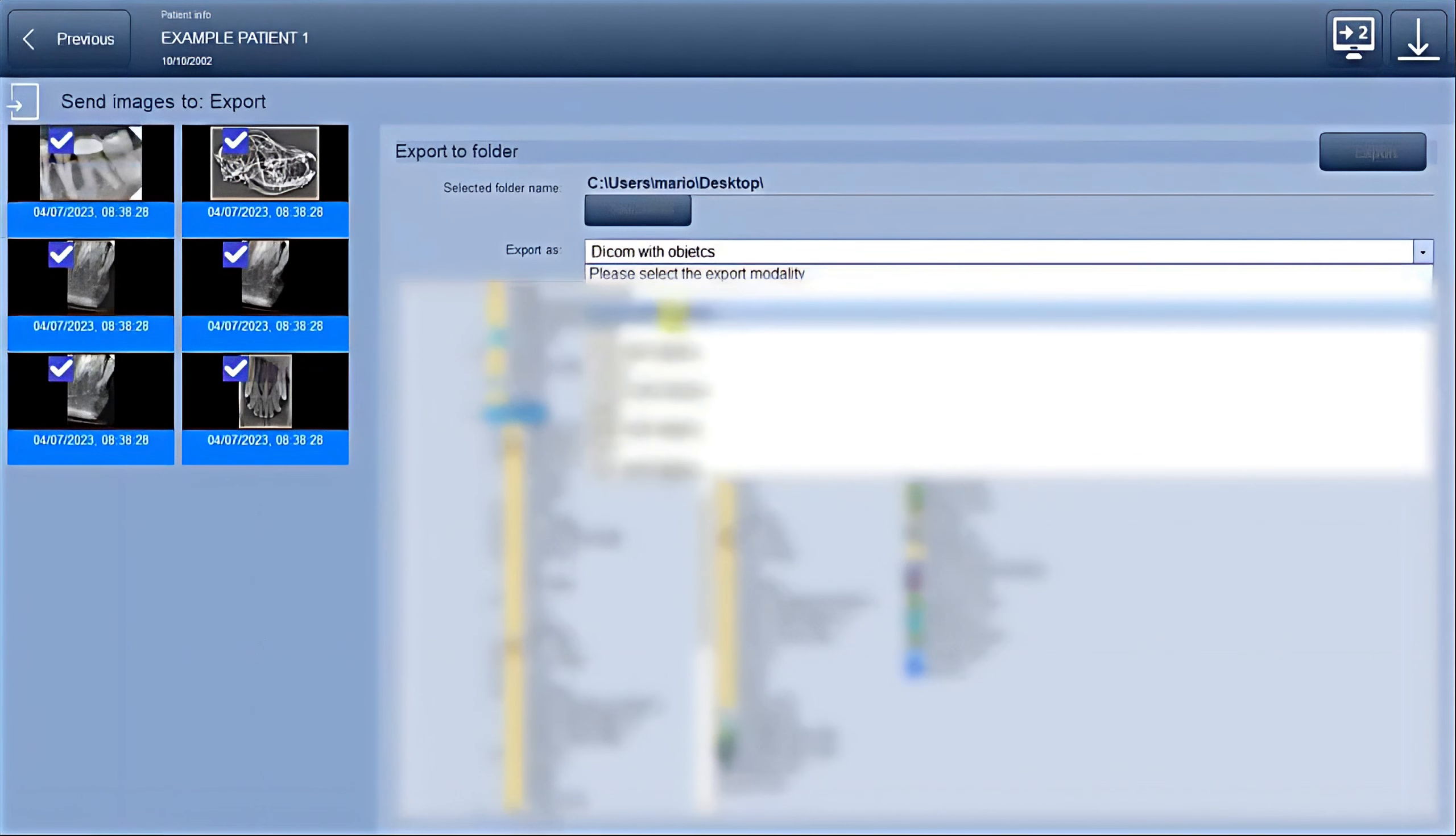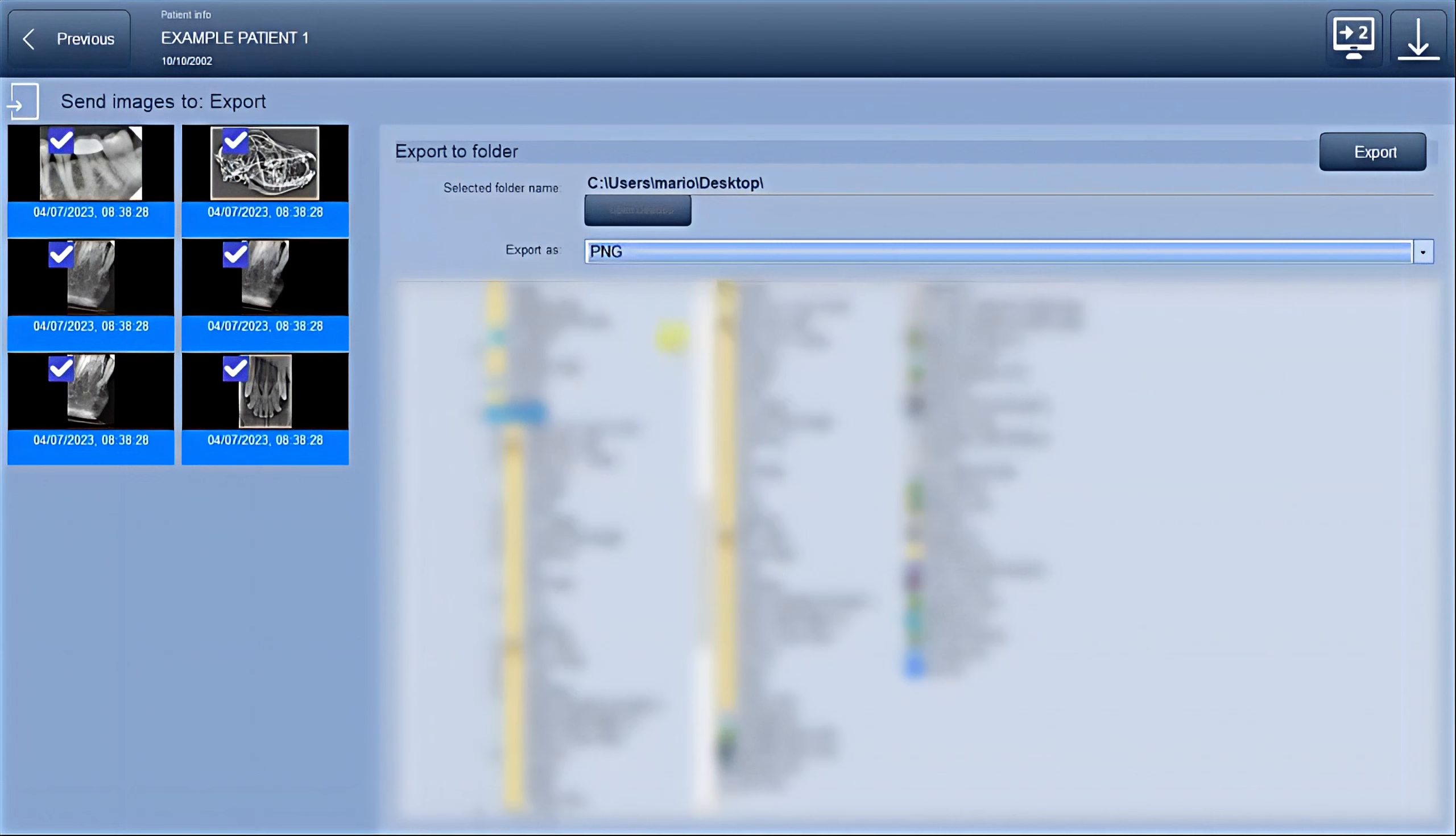keep an eye out for a green check icon that will appear next to the images. This indicates that the images have been successfully exported.